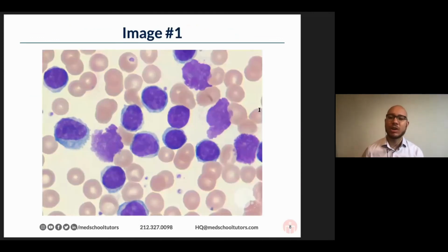So here's where we're going to get you all actively participating. So take a look at this image. And for those who immediately know what this is, please go ahead and put it in the chat. If I'm looking over to the side, it's because that's where I have the chat. I'm not ignoring you. Thank you so much for folks who are already chiming in. This is a zoomed in view, and I'm already getting a couple of answers. Beautiful.